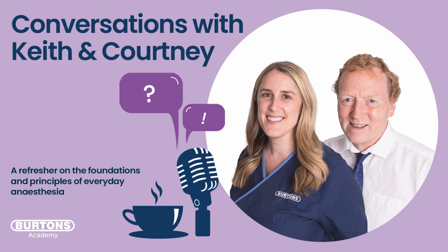I talk to a lot of nurses, a lot of vets. A lot of people don't think in terms of minute volume. They think in terms of tidal volume. So, if the animal's not breathing enough, we make the breath bigger. Well, you don't have to make the breath bigger.